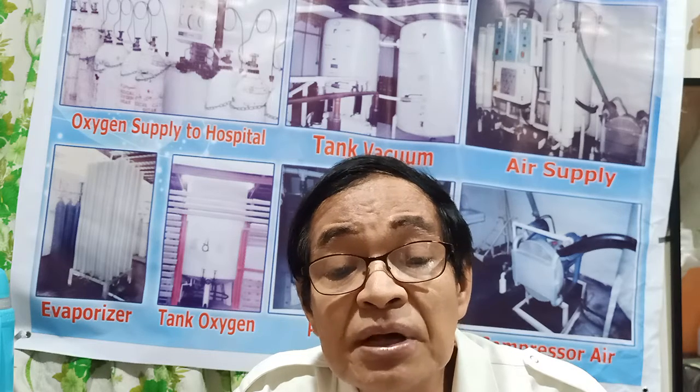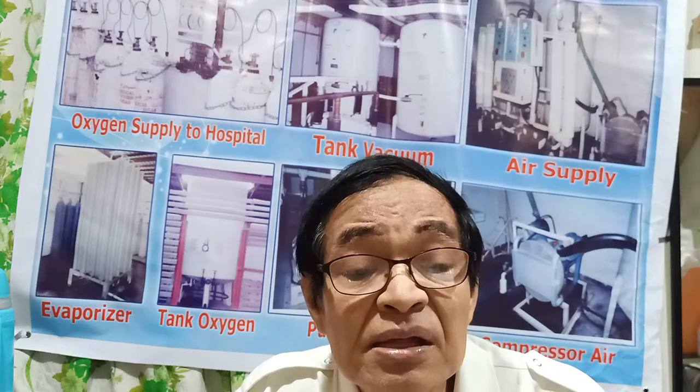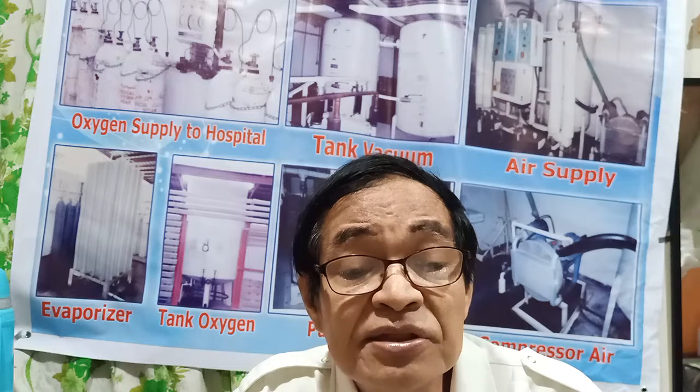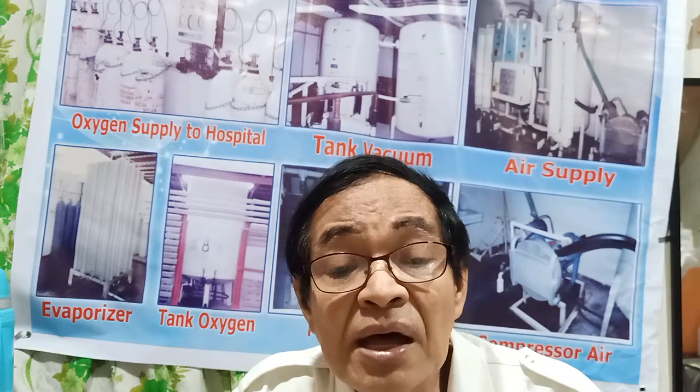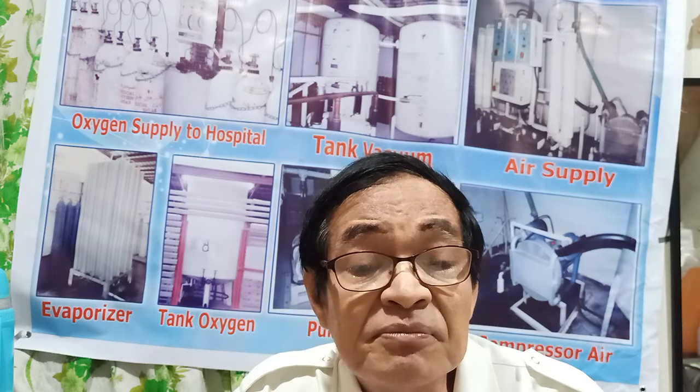The pipe of the cylinder supply of medical gas into the building is via an isolating valve and non-return valve arrangement.